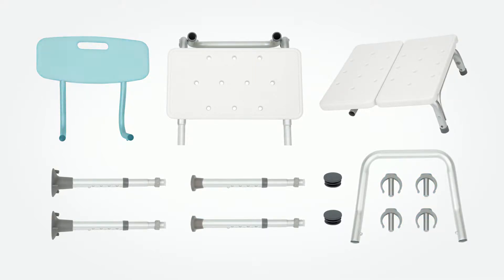You will also find one backrest assembly, one armrest, and two backrest frame caps.